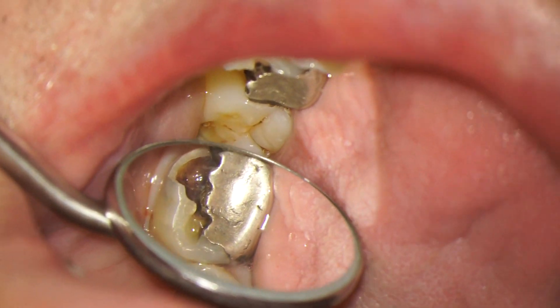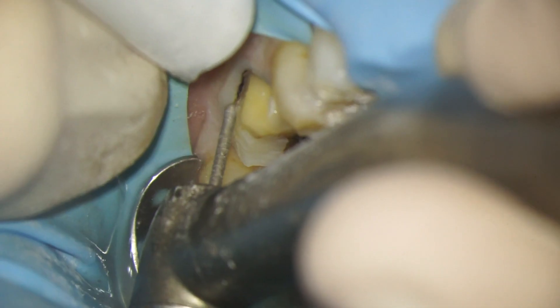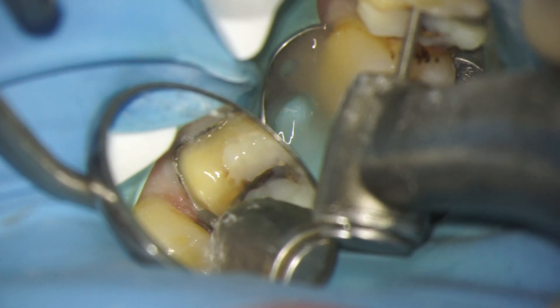My patient has very graciously agreed to let me film me trimming his tooth up for a crown. He has a broken tooth with a big piece missing, so we're going to clean out all the decay associated with that break, build it back up, trim it down, and get it ready for a crown. We'll get to showcase the new technology in action, which is pretty cool.